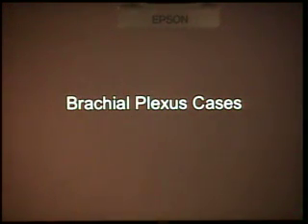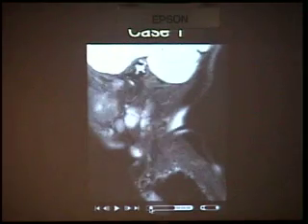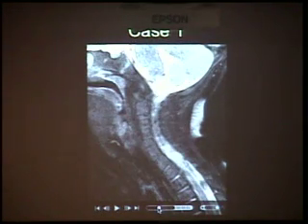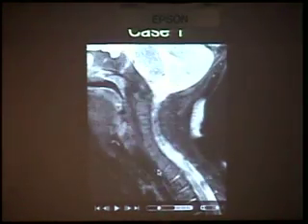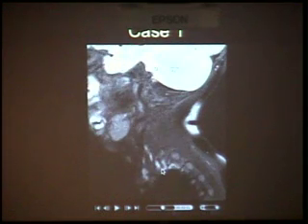So we're coming toward the end. We've got, I don't know, 5 to 10 cases here. These videos go pretty fast, so I'm going to scroll back through them. Again, I like to start at the cord and work my way out. This is a kid who fell, and so just following it out, you start to see the nerve roots coming out. Right through there, they're coming out and going down toward the axilla. And I'll show you the coronal images as well.